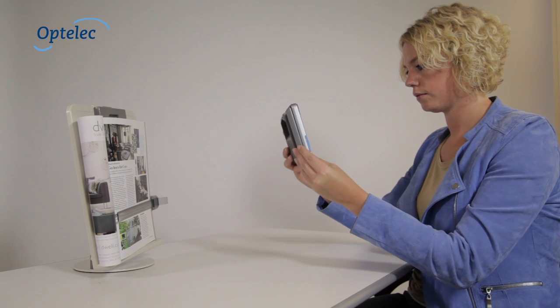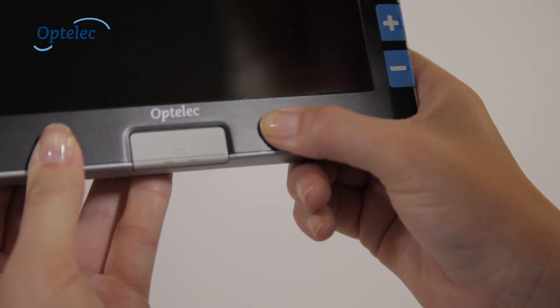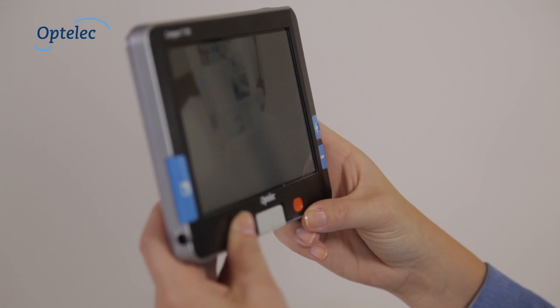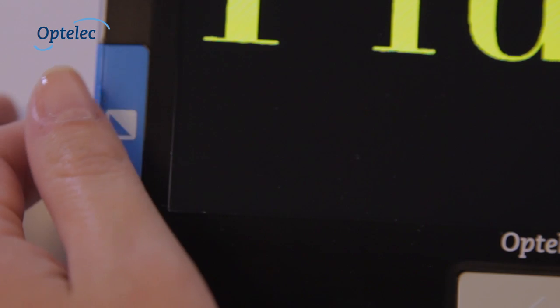The Compact 7 HD can also be used in the closed position. Turn the Compact 7 HD on by pressing the On-Off button. You can then select the magnification and color settings.